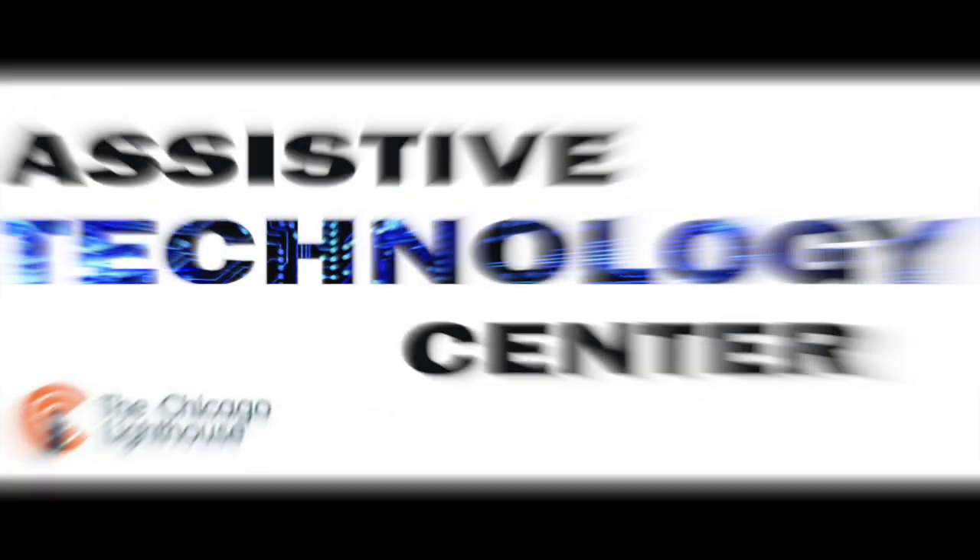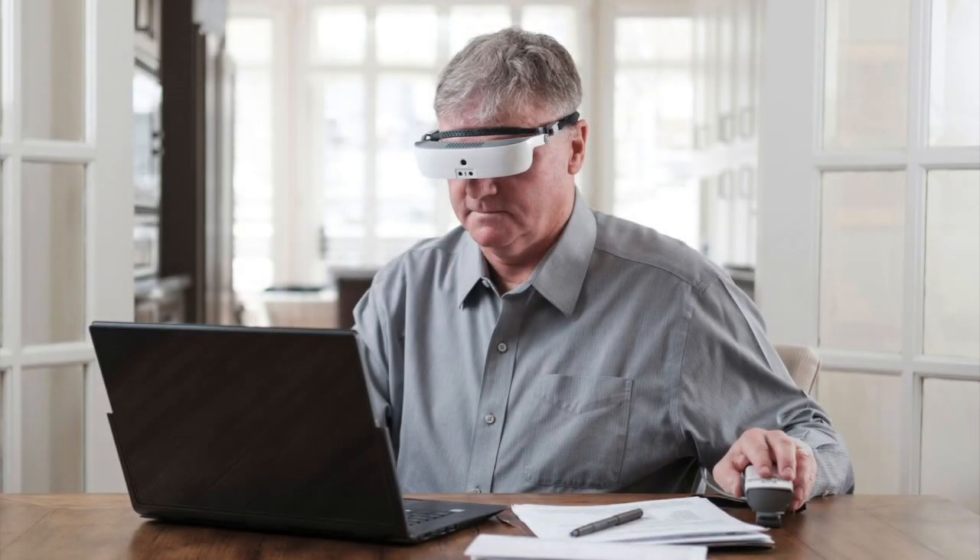The Chicago Lighthouse Assistive Technology Center presents a demonstration of the eSight 3 electronic glasses. Hello, this is Luke Scriven here at the Chicago Lighthouse. I'm here today to talk about the new eSight 3, which is a wearable electronic magnifier made by eSight. You might have seen a previous video I did on the eSight 2, their previous model. However, this one is new and improved, looks quite different, and has a bunch of exciting features we're going to look at today.